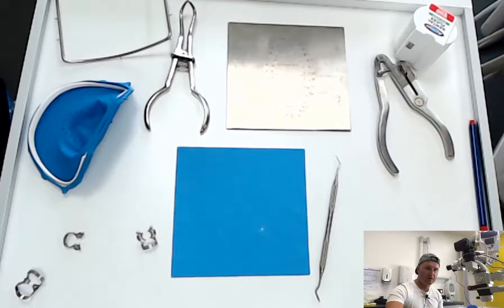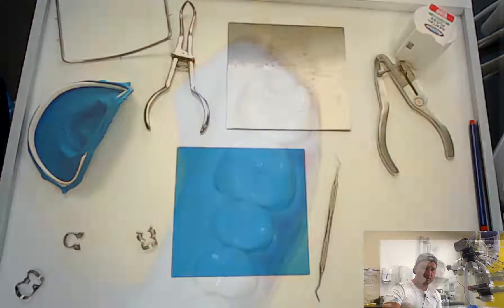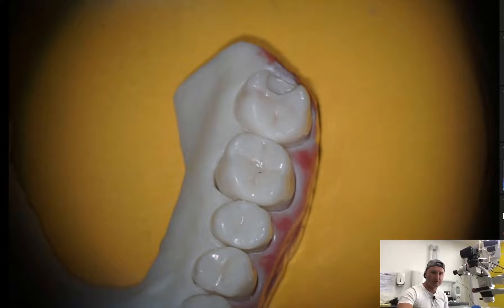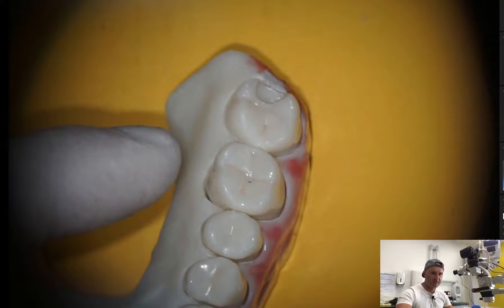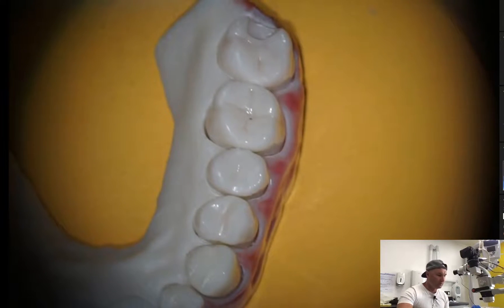Good morning everybody, Mark in the dentist, another dental MacGyver. Today I'm going to show you how to put the rubber dam on in the simplest clinical situation in which we are going to perform a root canal treatment, in this case on tooth number sixteen.